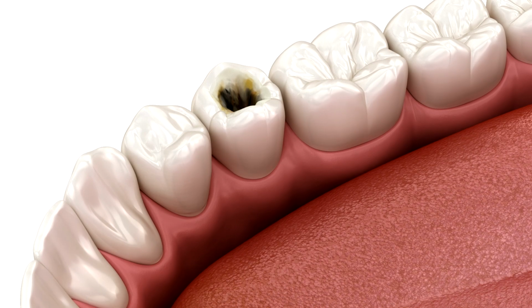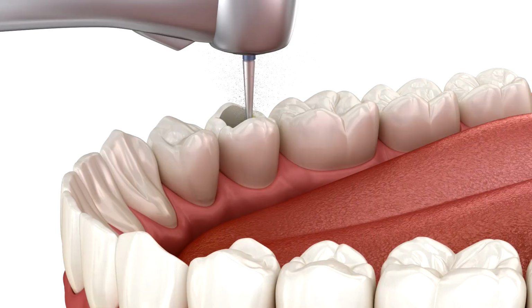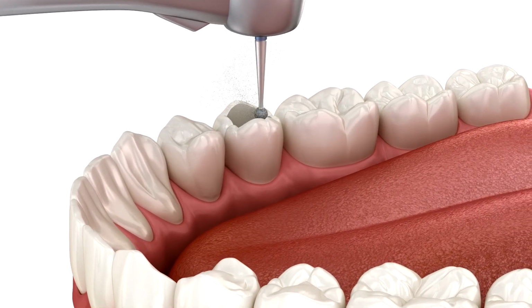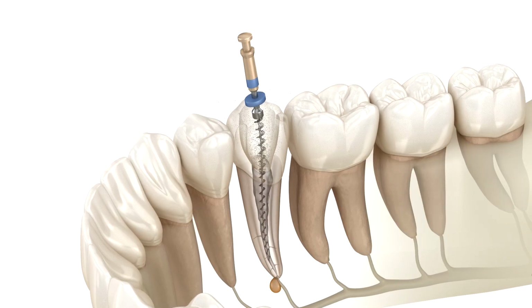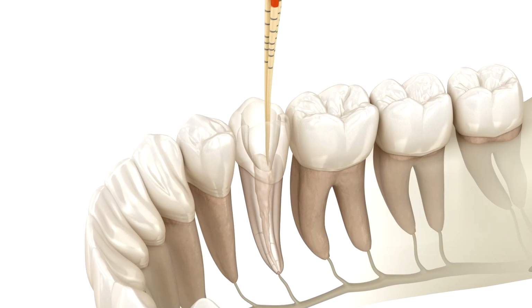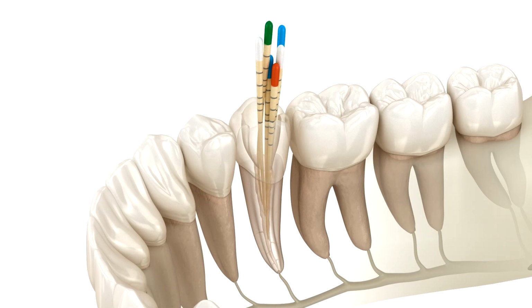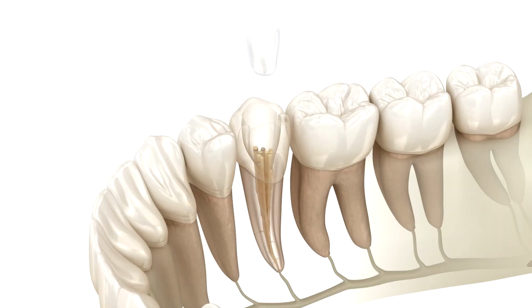Once the last layer is cured, it's all about the final shaping and polishing. Using fine finishing burrs and polishing discs, the dentist perfectly contours the filling to match the tooth's original anatomy and make sure your bite feels normal. The surface is polished to a high gloss, making it smooth, stain-resistant, and feel just like your other teeth.